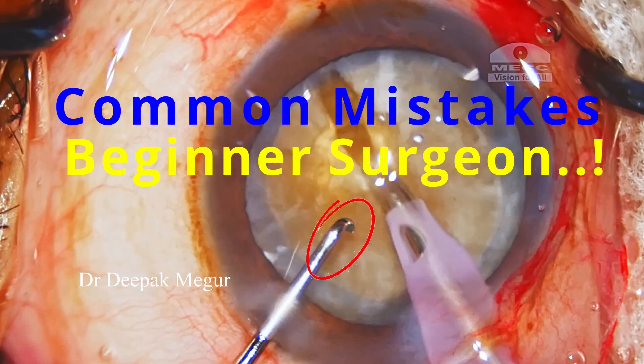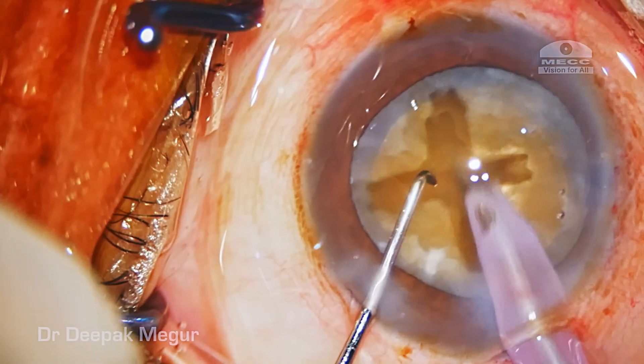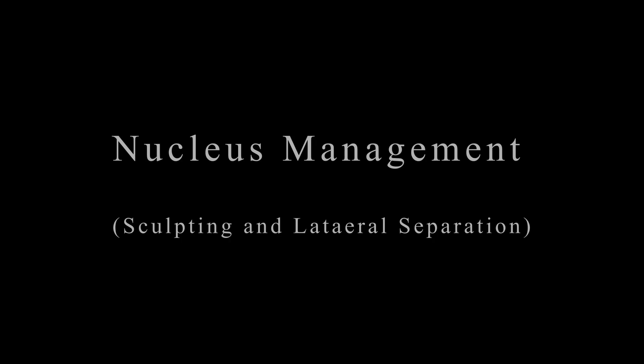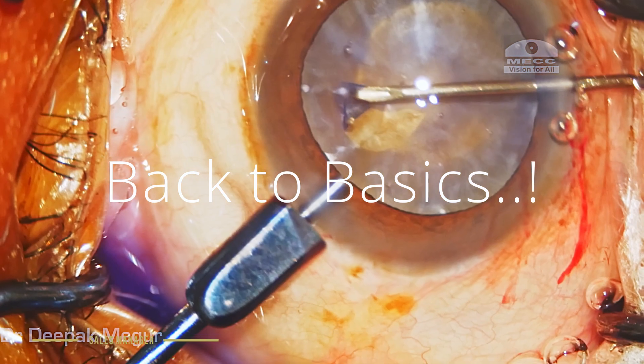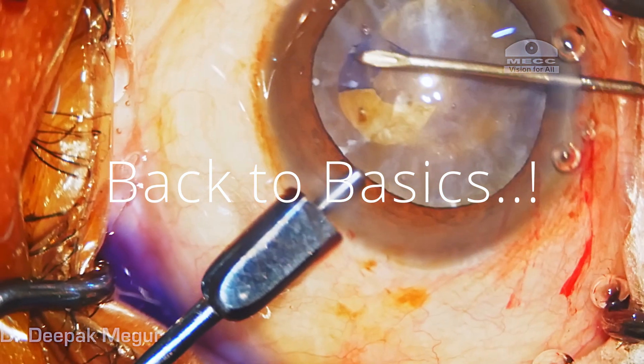Hello friends. In the Back to Basic series, today let us learn about a few common mistakes that most beginner surgeons would make in the early part of their surgical career. In this episode I'll be talking about nucleus management, which would basically be sculpting and lateral separation. The Back to Basic series is primarily targeted at eye surgeons who are in their early part of their surgical career, and the residents and the fellows.